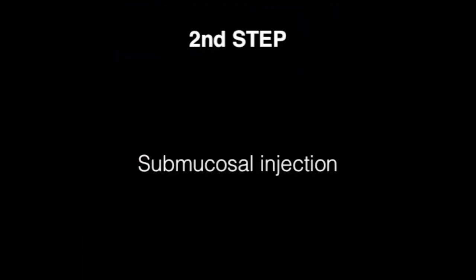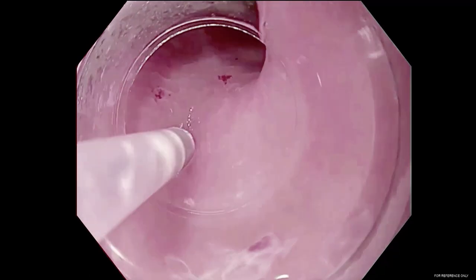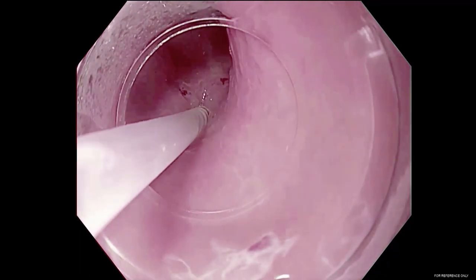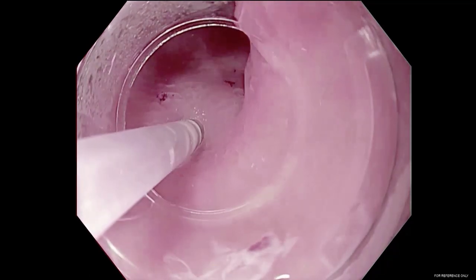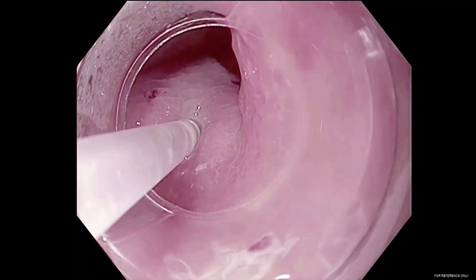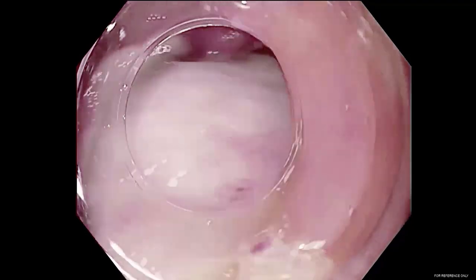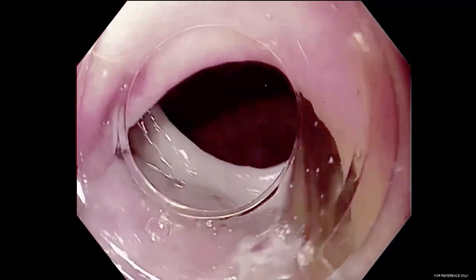The second step is the submucosal injection. We checked the stenosis and performed the injection 5 cm proximal to it. We used an injector needle and injected 40 ml of saline with a very light solution of methylene blue without epinephrine.